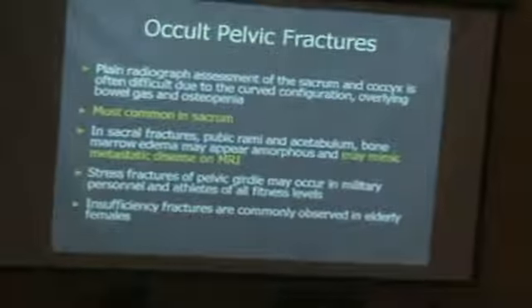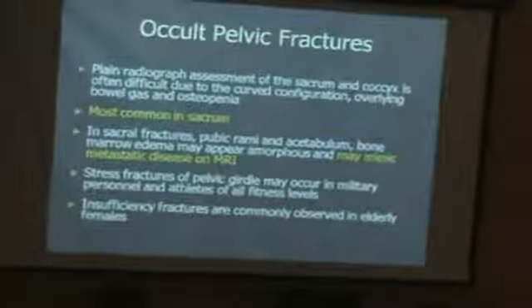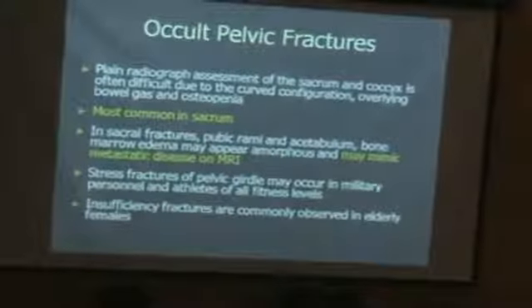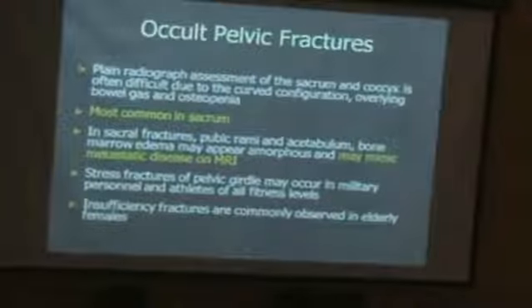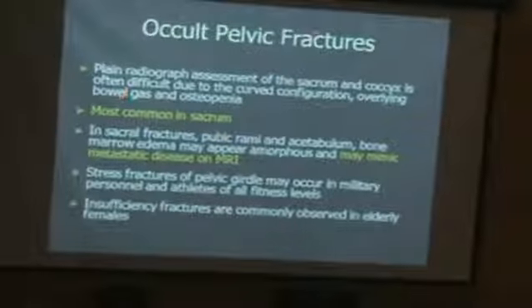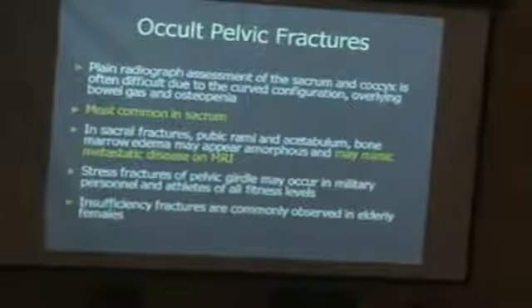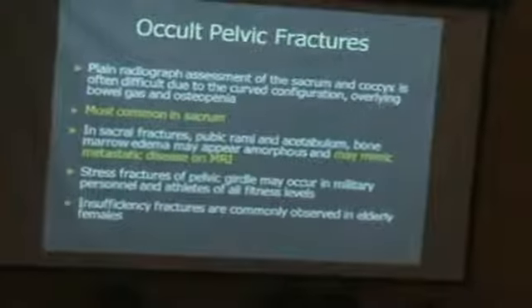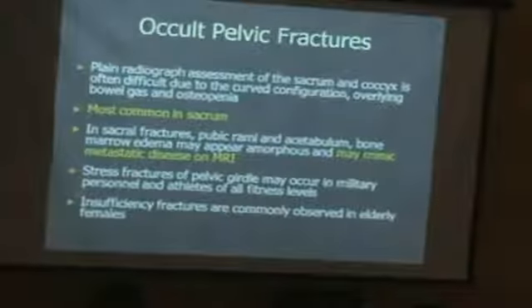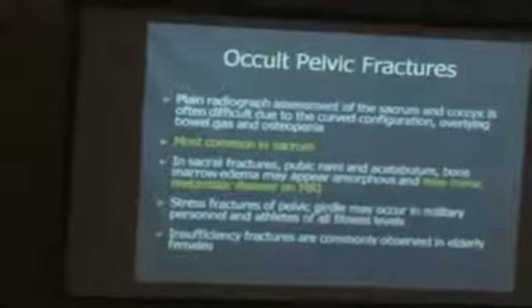And for three reasons. The first one is that the anatomy is a little bit difficult, it's all curvatures. The second is the superimposition with the gut and all the air in the gut, etc. And the third one is especially the osteopenia. Osteopenia renders the interpretation very difficult. Most of the time, the patients you send are female and postmenopausal, and most of the time they have osteopenia. So it is really very difficult to grasp a fracture in the pelvis.